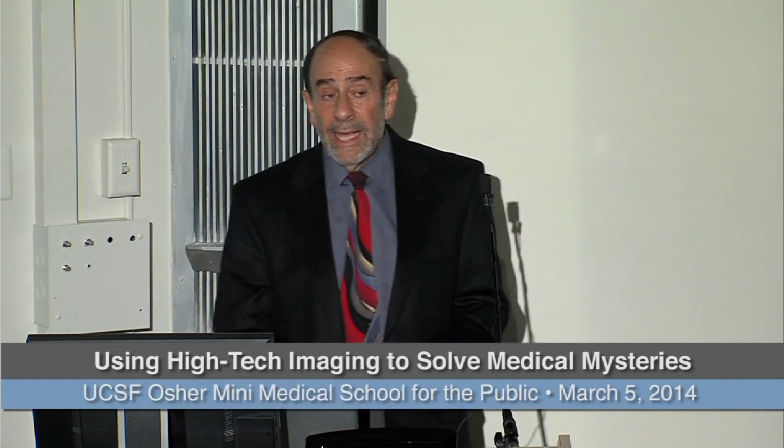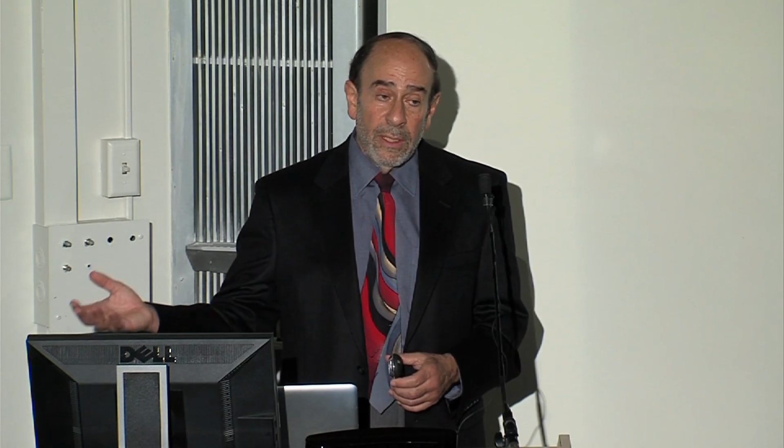And we now guide intraoperatively surgery based on preoperative 3D images, image guidance, and with instruments that have almost like GPS in them, where we know in space where they are relative to the patient's anatomy, because there's registration between the patient's anatomy and that preoperative 3D or whatever imaging it was used and the instrument itself. So it cuts down on complications, makes it more precise, particularly helpful in neurosurgery, et cetera.